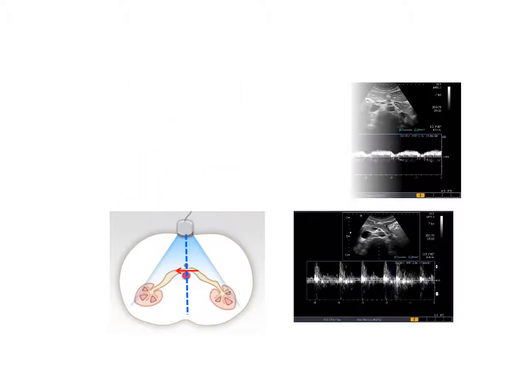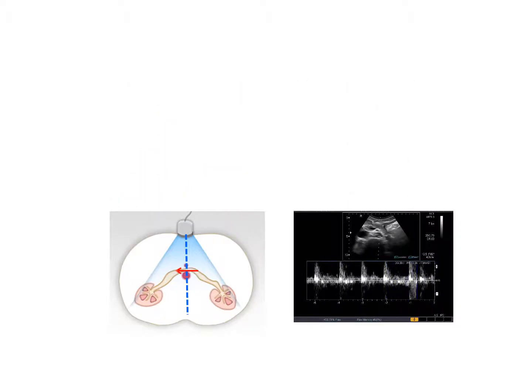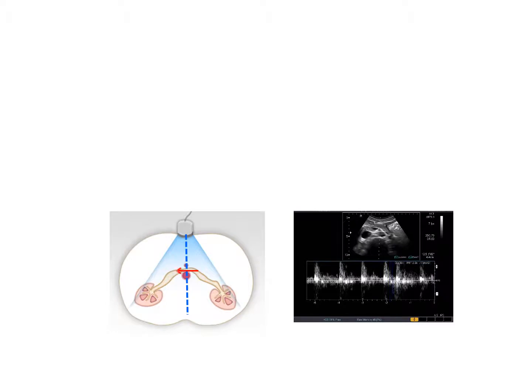But it is almost impossible to get clear Doppler spectra from this aorta-mesenteric portion, because the Doppler angle is around 90 degrees.